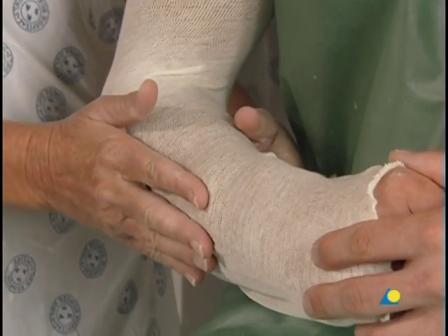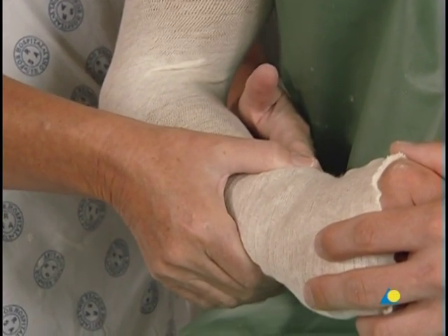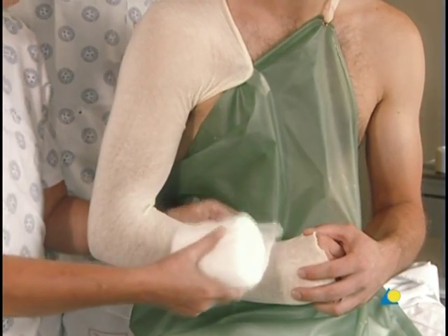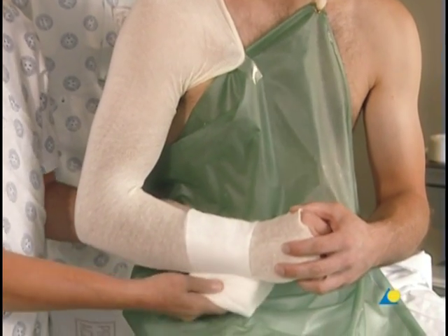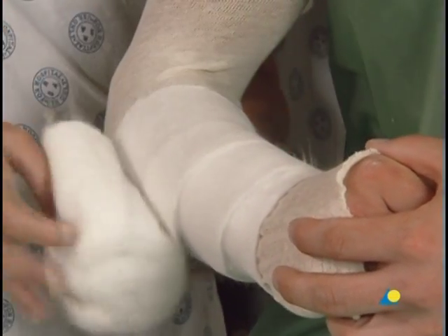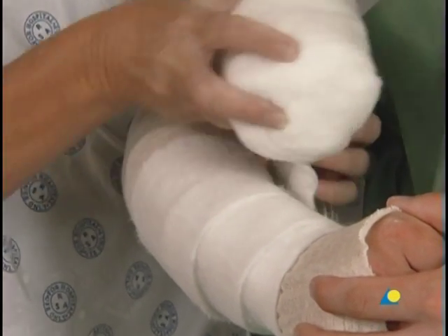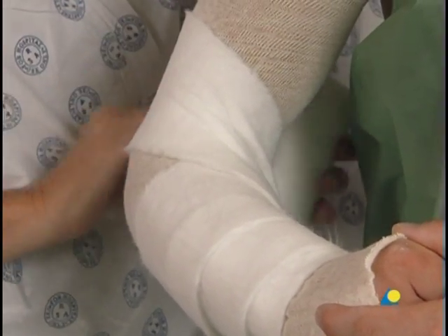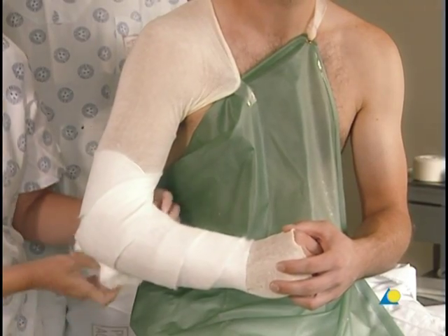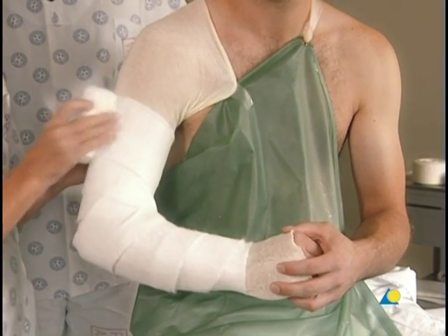To help reduce pressure on the ulna, the distal border of the modified shoulder splint lies at the wrist. The cotton wool is used for undercast padding. It is gently wound once around the wrist, then towards the elbow with an overlap of 50%, which creates a double layer of padding. To avoid constriction, the edge of the cotton wool should not lie within the crease of the elbow. Rather, it should be wound around the elbow as demonstrated, and then continued as far as possible towards the shoulder, up to the axilla.